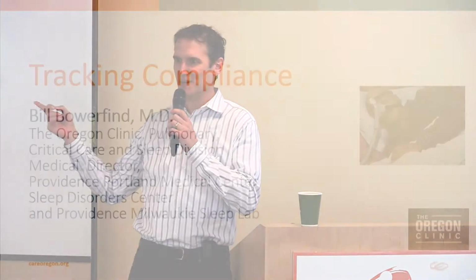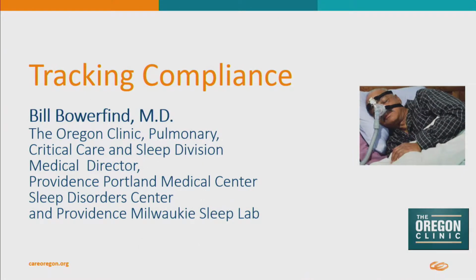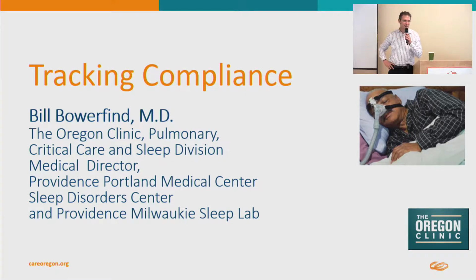One thing is about the Soclean device. I assume all of you have seen those commercials about the Soclean device. It's actually not a bad device. A lot of patients assume that it takes the place of cleaning the masks. Did you guys talk about it over there at all? The Soclean device is an ozone device that sanitizes and sterilizes the equipment. It is not like a dishwasher, though.